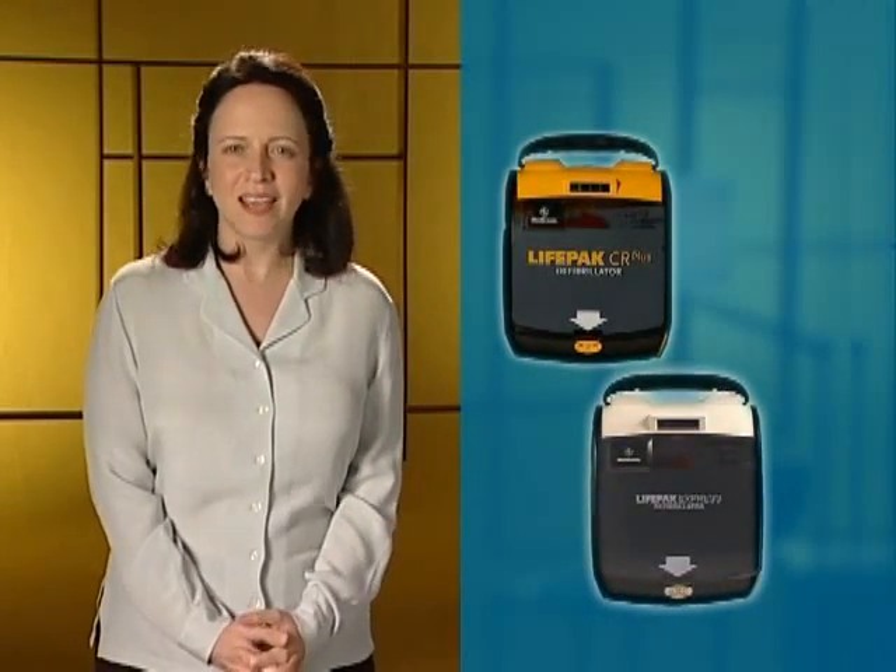Sudden cardiac arrest is a leading cause of death. A lot of victims have no warning symptoms — it just happens. A person collapses suddenly, unconscious and no longer breathing. It can happen anywhere: at work, at home, or anywhere else. I'm here to show you how to use the Medtronic LifePak Automated External Defibrillator, or AED, in case you need to help someone in cardiac arrest.